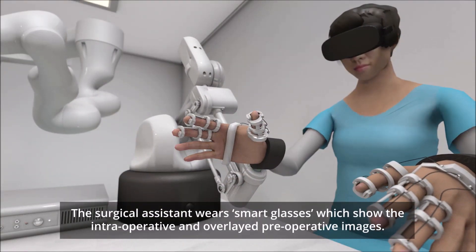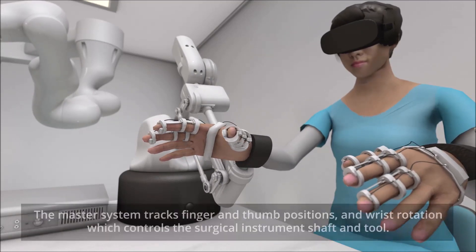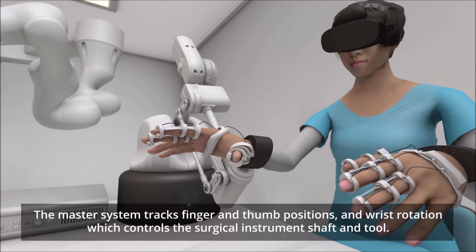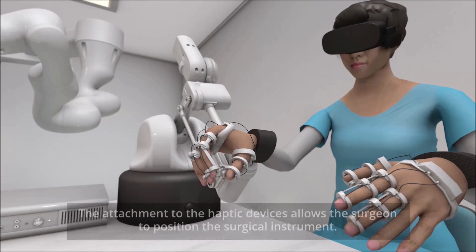The surgical assistant wears smart glasses which show the intra-operative and overlaid pre-operative images. The master system tracks finger and thumb positions and wrist rotation, which controls the surgical instrument shaft and tool.